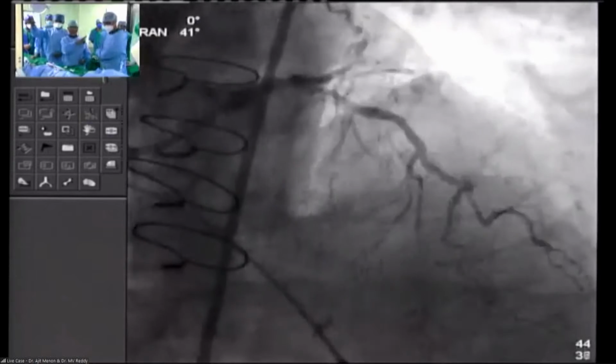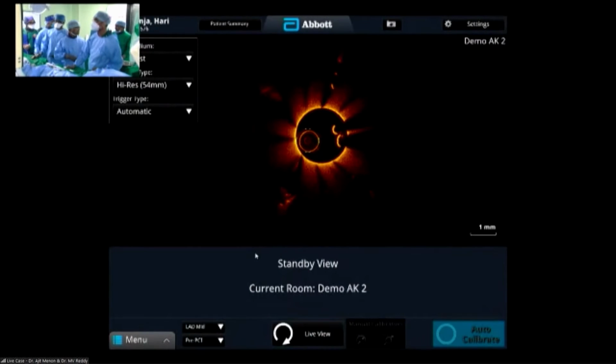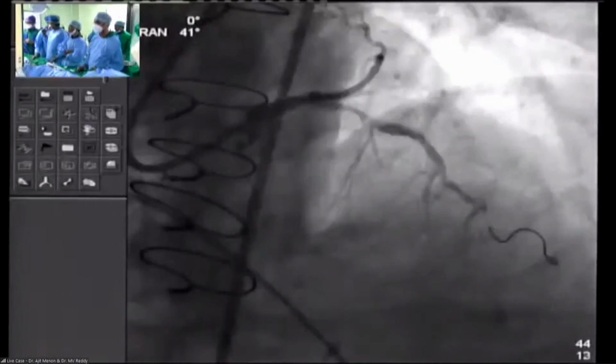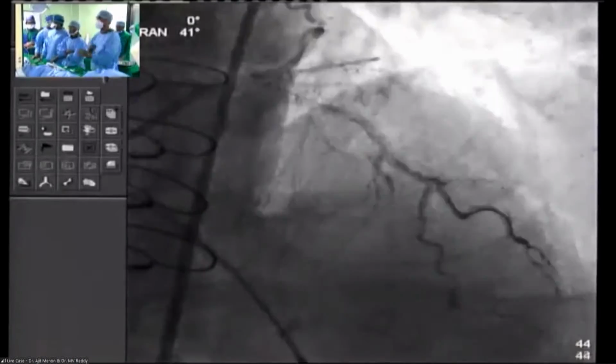There. It's really difficult to understand that a small diagonal like that can cause so much instability. Well, that was the only compromised flow there. Unless there was distal stuff going on downstream. I mean, it's not a small diag, it's a reasonable sized diag, but I agree. I don't think that the patient should have a wide QRS, and it seems like it's a more global thing. And he has a good right coronary, which is normal.